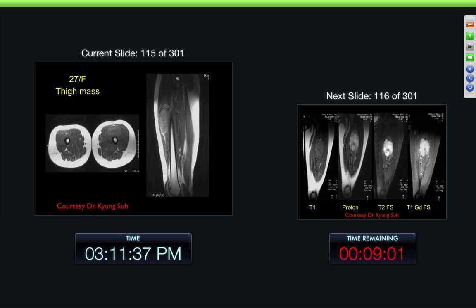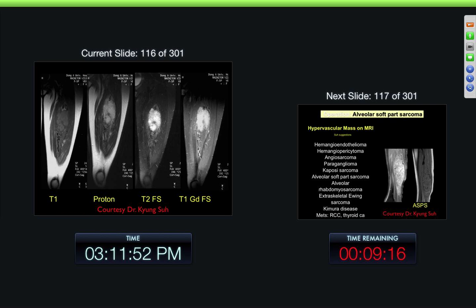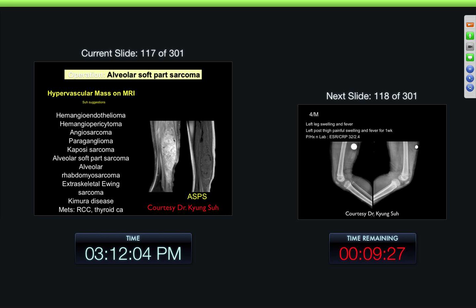And then the skeletal muscle — 27-year-old female with a thigh mass. Again, fairly sharply demarcated. In this case, relatively uniform. Some areas of inhomogeneity on the T1-weighted image and what looks like maybe a little fibrous band or a low-signal band within it. A little bit more inhomogeneous with the proton density sequence and the T2-fat-sat and T1-fat-sat images with contrast. And this was an alveolar soft part sarcoma. They tend to be vascular masses.